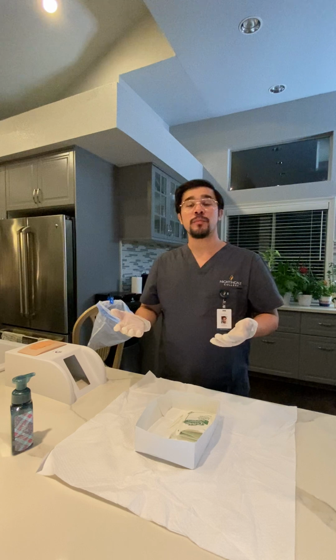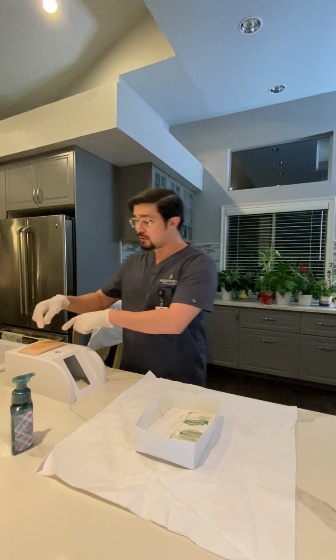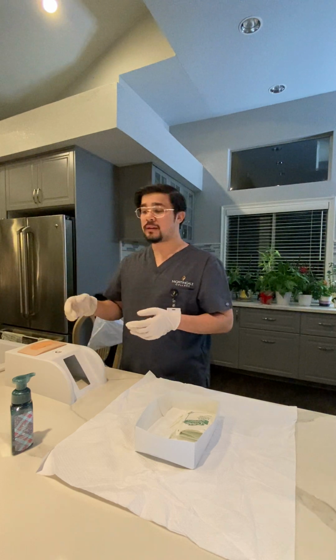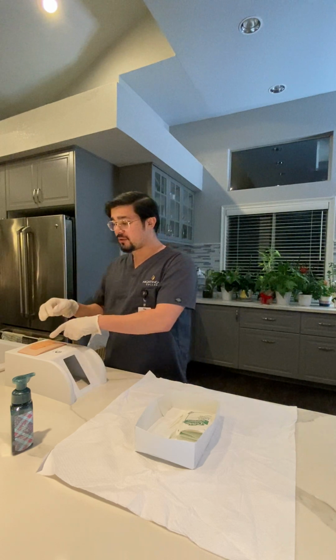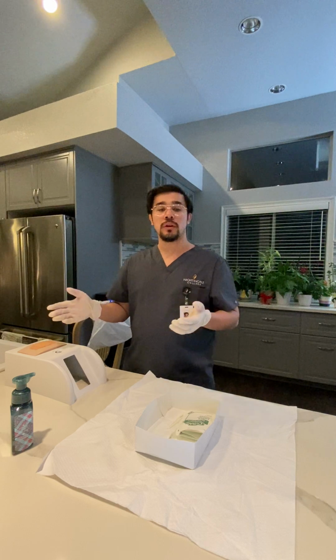So I'm going to be removing the bandage, and to do so, I'm going to pull up and towards the center of the wound. I'm going to do that with the grain of the hair to make sure that there's no pulling on the hair. And I'm also going to pull and remove the bandage parallel to the wound.